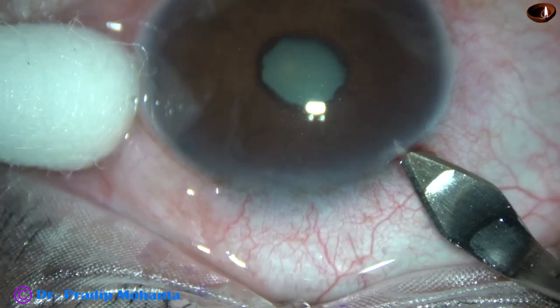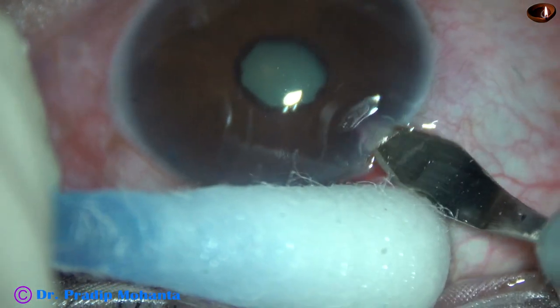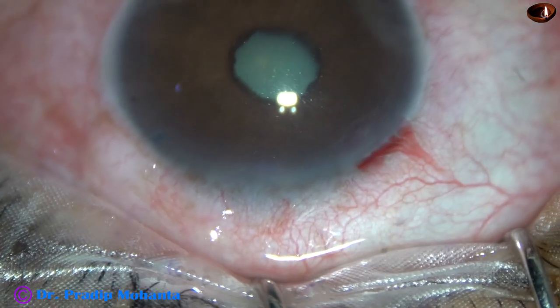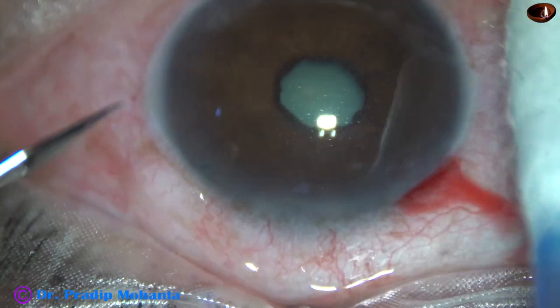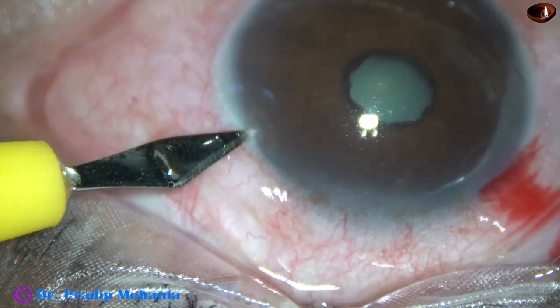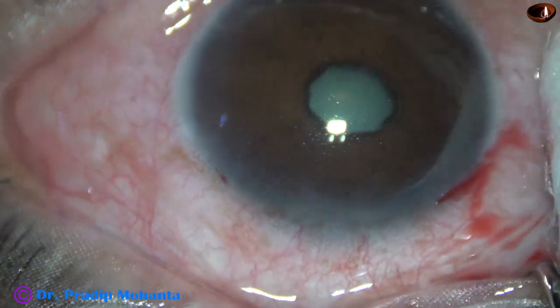This is the main incision on the posterior aspect of the limbus with a 2.8 mm keratome. And now I am going to do a side port about 3 clock hours away from the main incision on the left side. This is at mid-limbus.